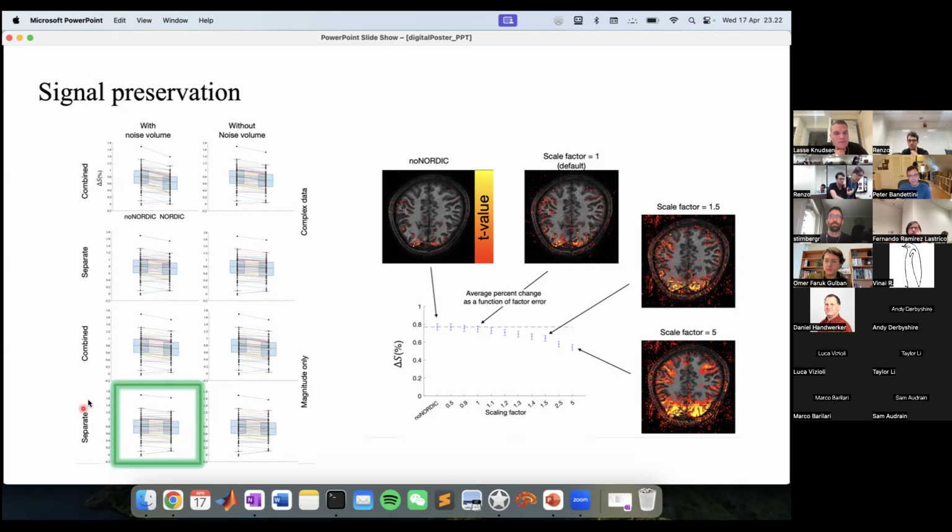Of course, you could also measure, using the PCA, how many components we have left, and do the reconstruction anywhere between 1, or technically 0, and the number of time points that you actually have in the analysis. That's your range. Yeah, that would be cool.